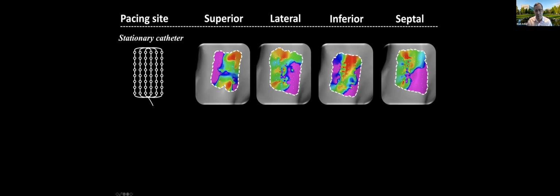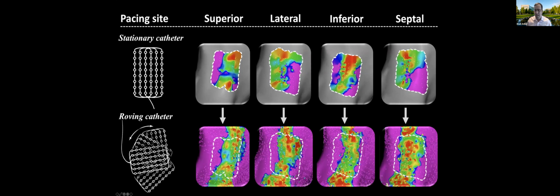So if you have a wavefront that comes from a specific location, the voltage map that you get is not going to be impacted by the wavefront, and you're going to see the highest voltage. So you're not going to miss areas of surviving myocardial bundles. And this is true. That actually was proposed by Jacques de Backer and Madison Spack 40 years ago, the idea of omnipolar potential mapping. The issue is that nowadays we move the catheter, from 90 degrees to 180 degrees, so you cover the same area at multiple footprints of the catheter.